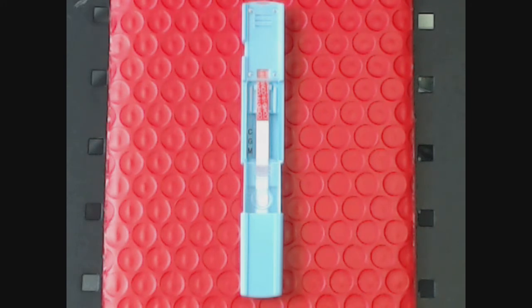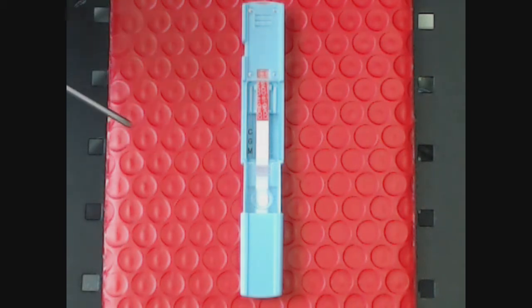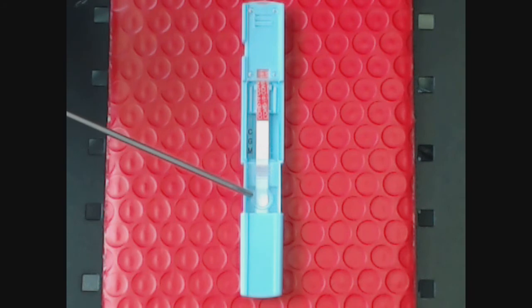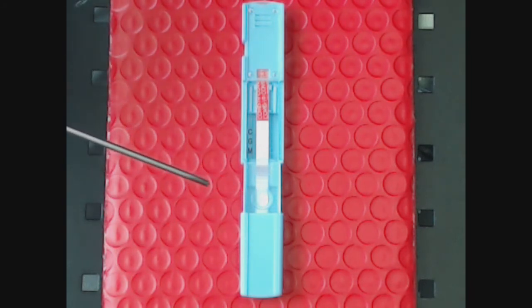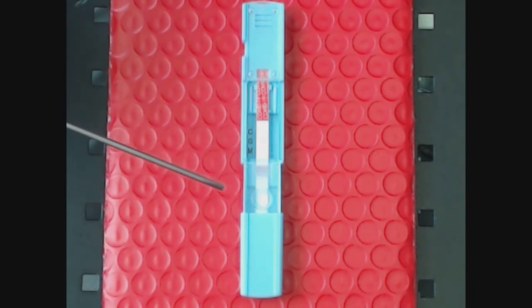First, you see an opening right here. This is going to be where your one drop of blood will be placed. After that, you're going to place two drops of buffer. Good rule of thumb is to do one drop of buffer, count to one thousand, and do a second drop of buffer.